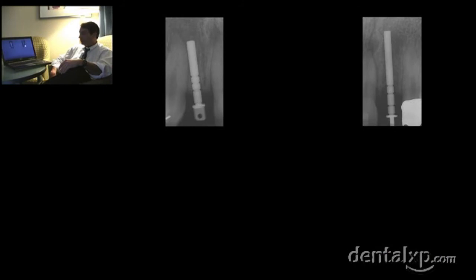So here we go ahead, and we're using a couple of 2 millimeter Gelb gauges to define where our implant should be placed. If you look closely at the x-ray on your right, the patient's left, the Gelb gauge looks pretty good. It's far enough away from the teeth. We have our zone of safety.